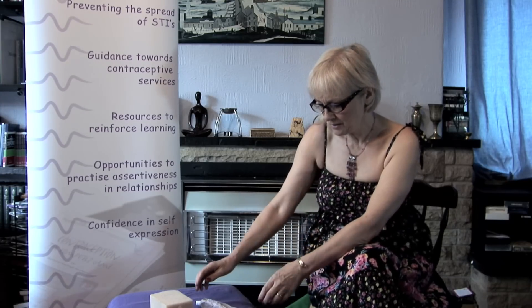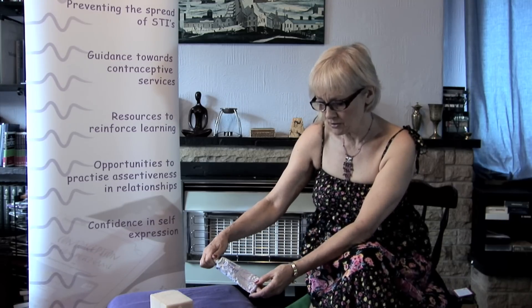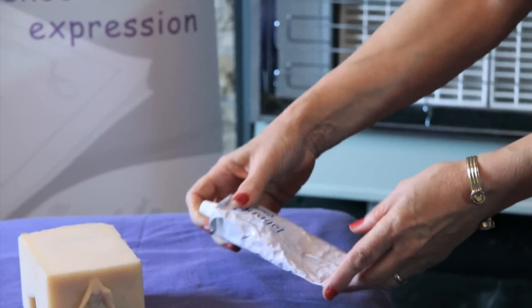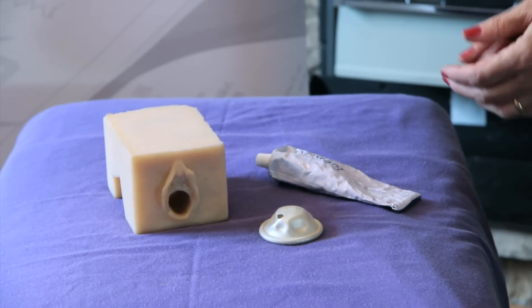This is never an airtight or watertight method, and so it's always got to be used with some kind of spermicide. Today I'm just going to demonstrate it with spermicidal gel, but it can be used with a spermicidal cream, a pessary, or a foam.